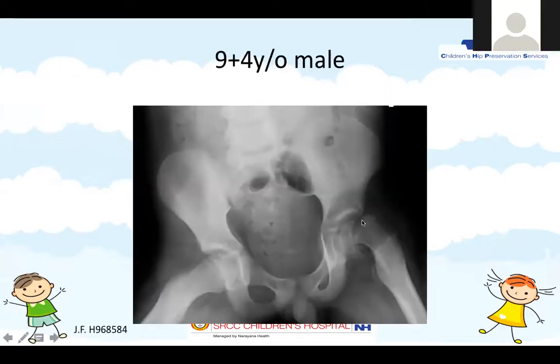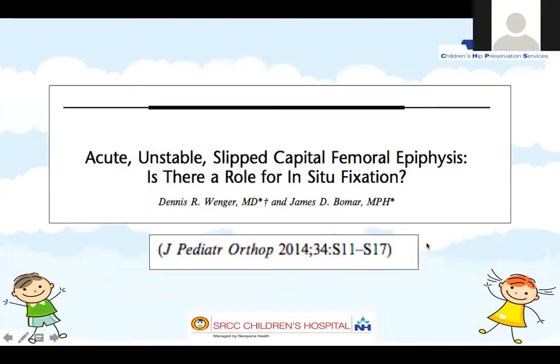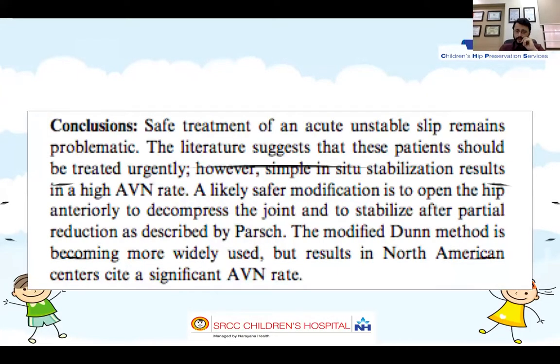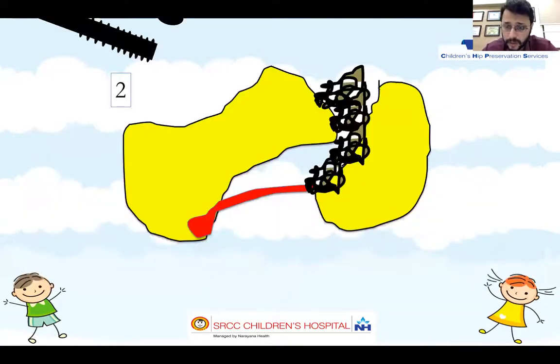So if you can see, this is an acute on chronic slip, but where there is a lot of callus here. So you just under reduce it till the level of chronicity and fix it. Right? So again, another article by Dennis Wenger, excellent thing. While they have said that a likely safer modification is to open it anteriorly to decompress and to stabilize further, as described by Parsch. So that is one which may be useful when we are not very comfortable in doing a surgical dislocation in an acute unstable slip.